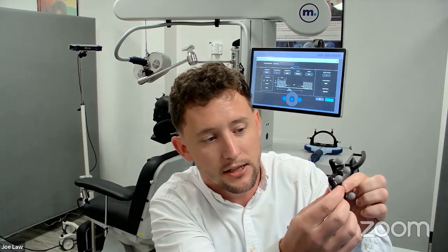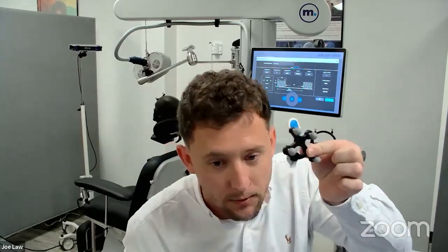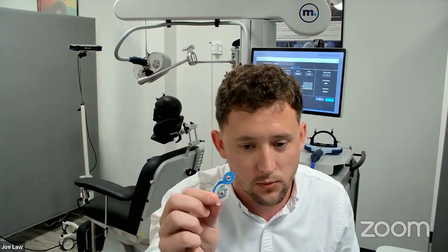So, for example, we don't charge you to use one of these every single time. The way you reuse this is you place EKG, EMG electrode stickies, any type of EKG, EMG electrodes. You can then peel off the label, stick that to the patient's head, remove these disposable electrodes, and use some more. So again, generic, there's no ties to us with these EKG electrodes. Again, not pay-per-use, not subscription-based, something I feel very strongly about. So yeah, that's a great question.